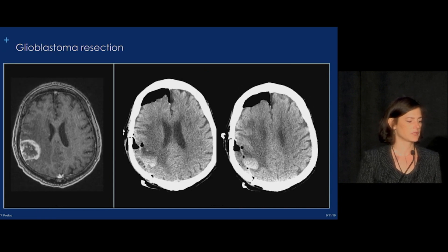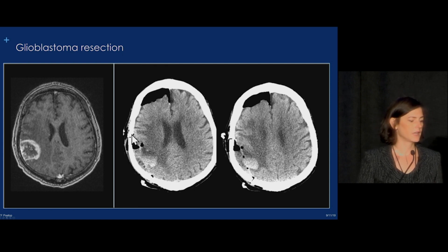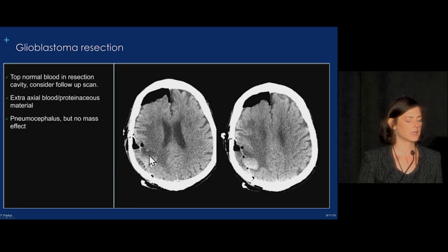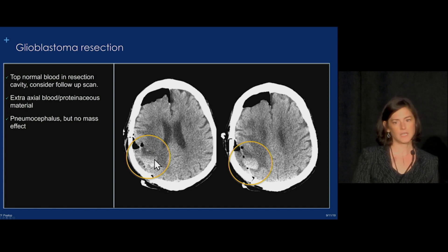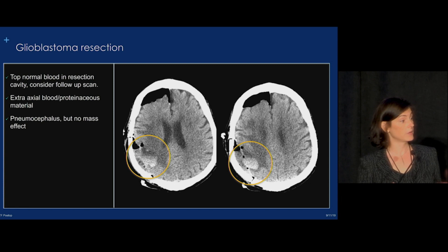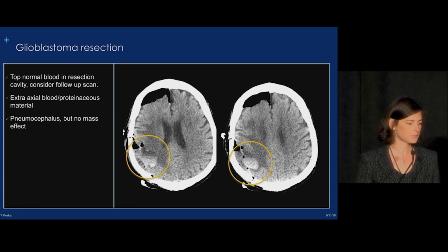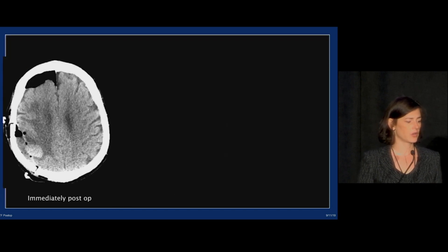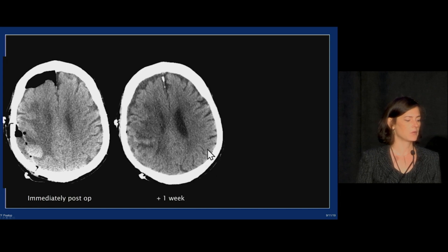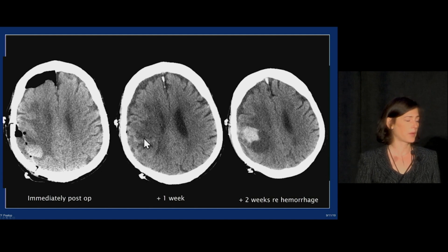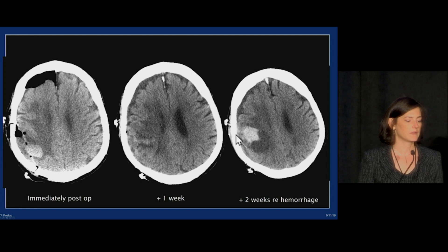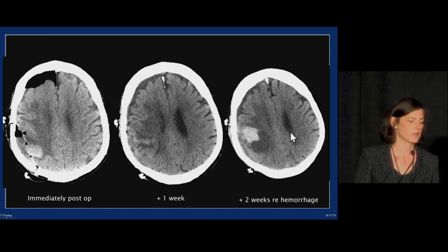Here's another glioblastoma that was resected. We see pneumocephalus and an extra-axial collection containing fluid and gas — both fine. But there's a little more blood in the resection cavity than we normally see. It's not frankly abnormal, but we need to watch it carefully. On follow-up about a week later, the hematoma had resolved. However, this patient had a propensity toward bleeding in that glioblastoma, because he unfortunately presented a week later with another hemorrhage.